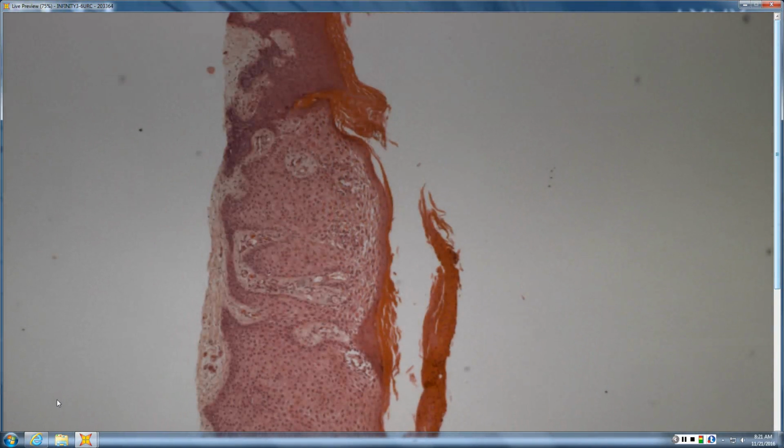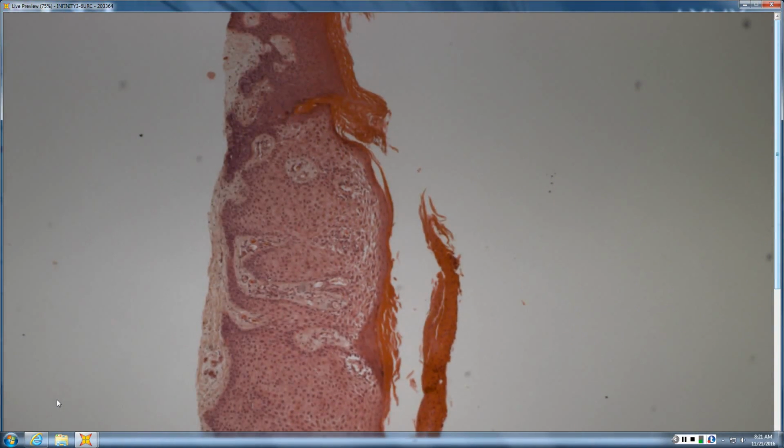Okay, how about this one? Clear cell acanthoma or pale cell acanthoma, another lesion that always has a scale crust over it, always has some neutrophils and karyorectic debris, an abrupt cutoff from the normal epidermis to the glycogenated.